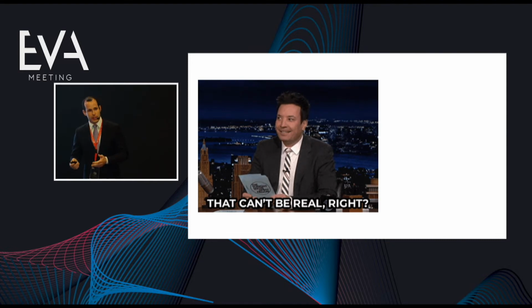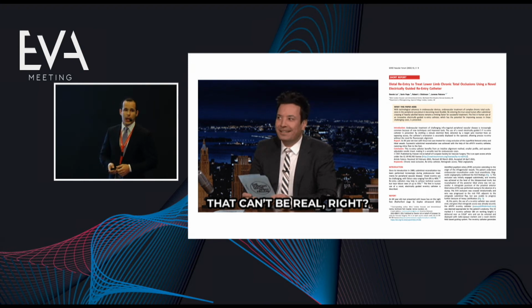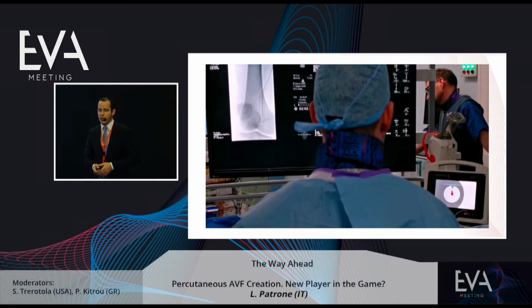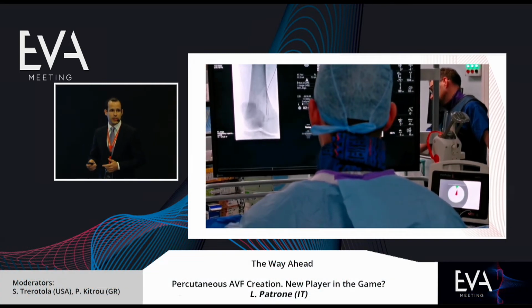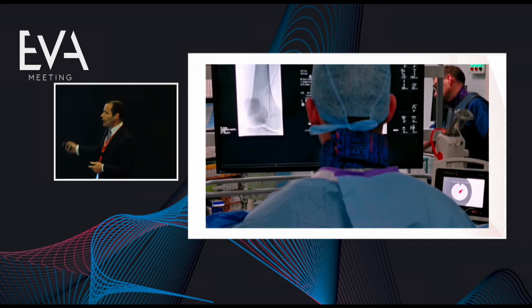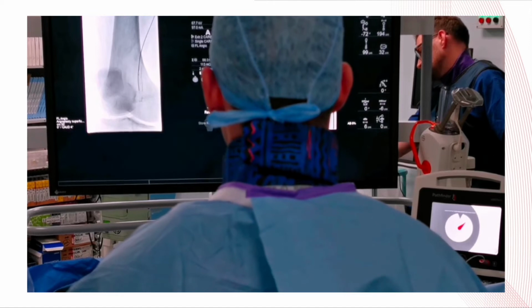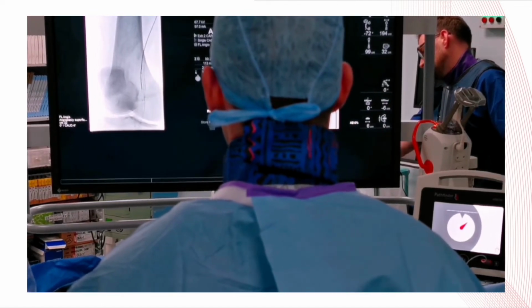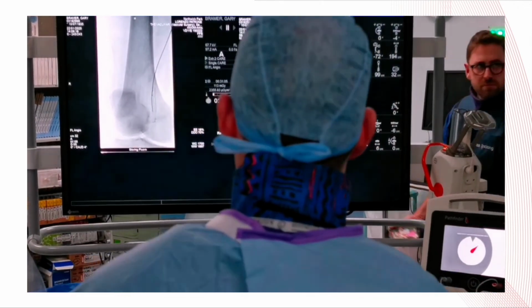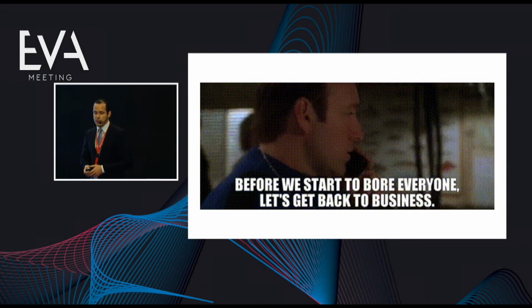Of course this is in vitro, so people can be skeptical, but we have already done this in vivo in human beings for lower limb recanalizations. This was a complex case of recanalization with two different accesses, antegrade and retrograde. There was dissection on both sides, and you can see I deployed the needle. You can see the screen here, which I use for guidance. I'm now advancing the wire, and you can see that the wire on the top left of the screen is advancing nicely into the distal part of the popliteal artery after crossing this dissection, with great pleasure of everyone. First shot.